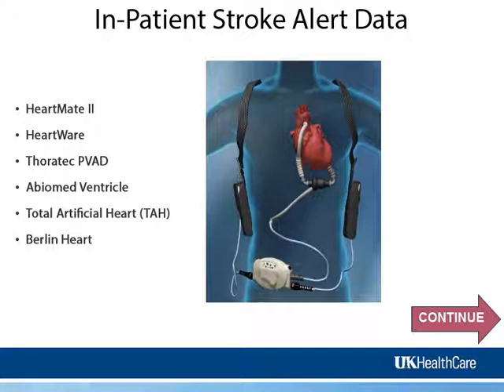Here at University of Kentucky Medical Center, we use mainly the HeartMate 2, Thoratec PVAD and the Total Artificial Heart, but we'll treat any type of VADs that come into our facility. Currently VADs are primarily for adults, but we will soon support our neonate and pediatric patients.